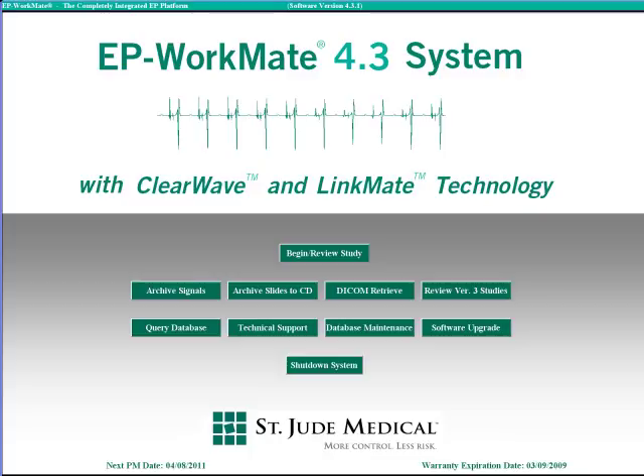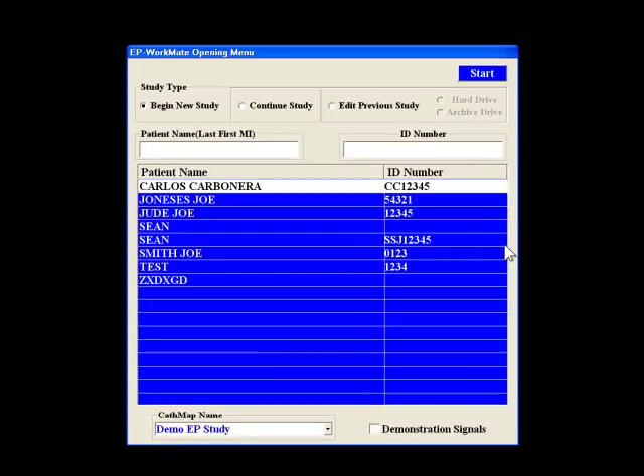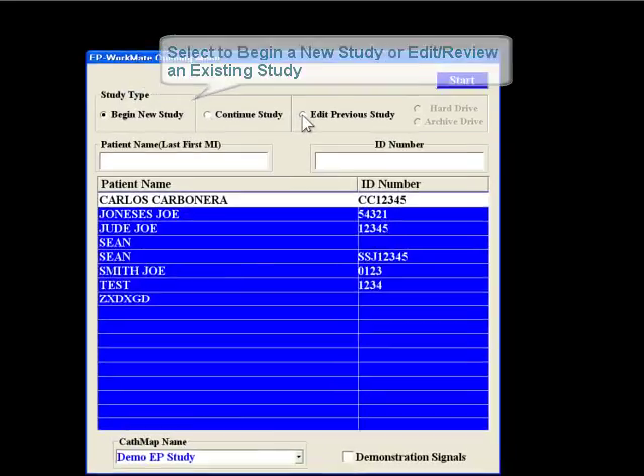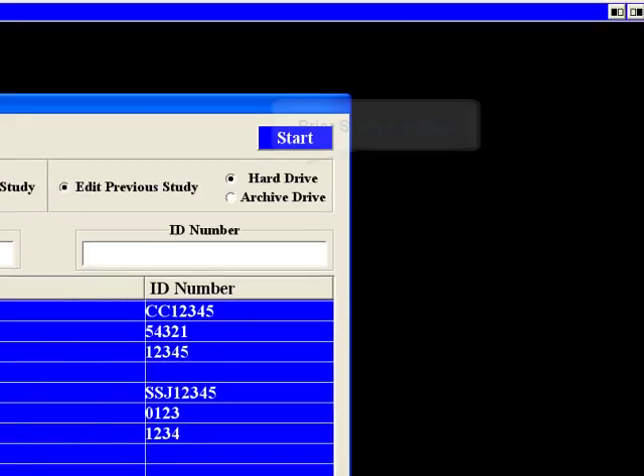When you want to begin a new study or review an old study with the EP Workmate Recording System, you need to click the Begin Review Study button from the main menu. When you click that button, you get the EP Workmate Recording System opening menu, where you can select whether you're here to begin a new study or edit a previous study. If you choose to review a previous study, you have to tell the computer where that previous study is located, either on the hard drive or the optical drive.